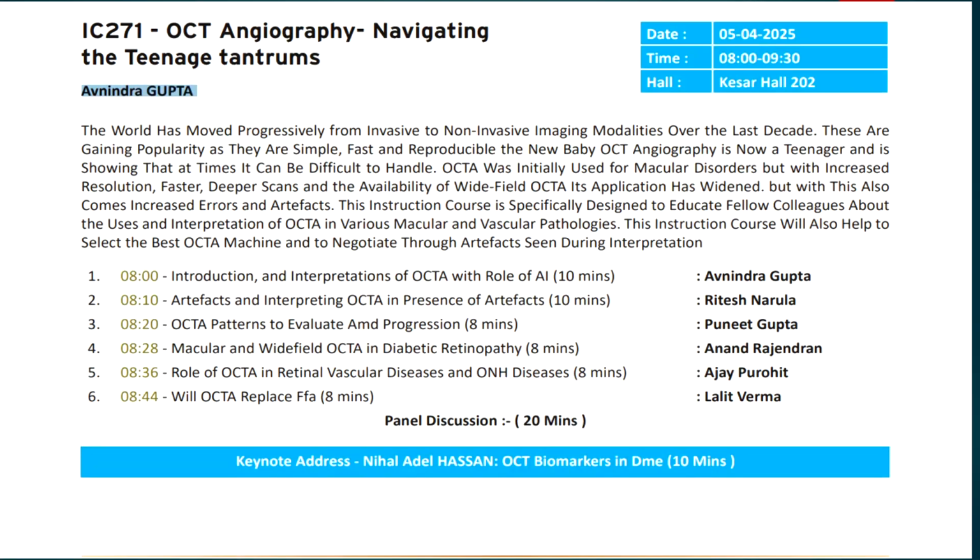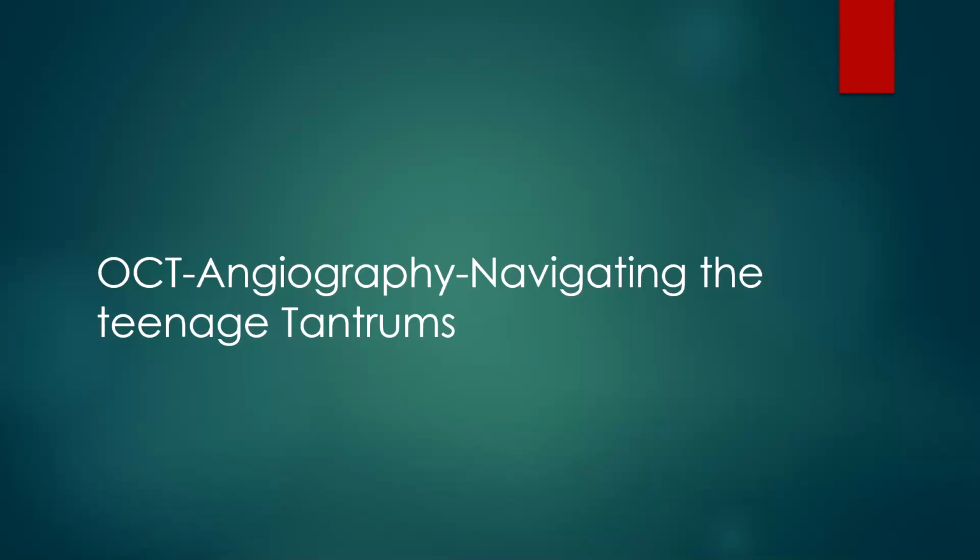We have a very interesting session on OCT angiography. OCT angiography is one of the most recent investigations or imaging tools in retina at the moment, and a lot of work is going on. That is one of the reasons why we wanted to inform the audience how to interpret it and what are the different conditions where we can do an OCT angiography to get maximum information.